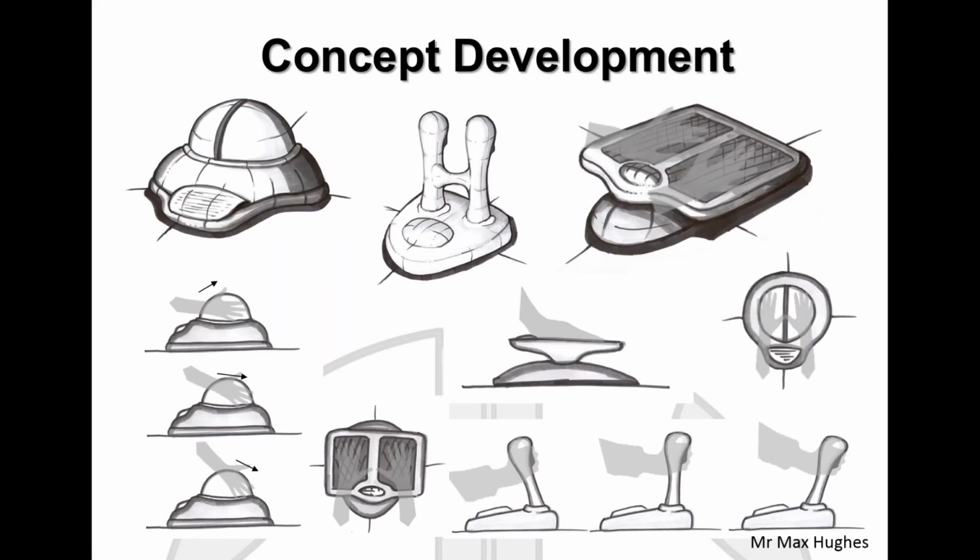And so today, with this particular example, the ideation process was taking away the ability or the need for fine motor control. So if you have a look at these sketches, which are here to help that ideation process move forward, except for the one in the middle, which has got a bit of an H look to it, I'm sort of moving my mouse over it now. They don't require grip or fine motor control.